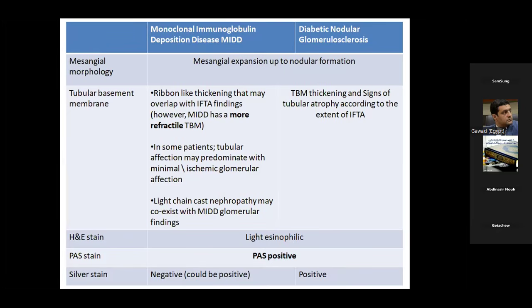So let's see what we can see in MIDDs. The tubular basement membrane could be thick, and it will be more refractile under light microscope for MIDDs.